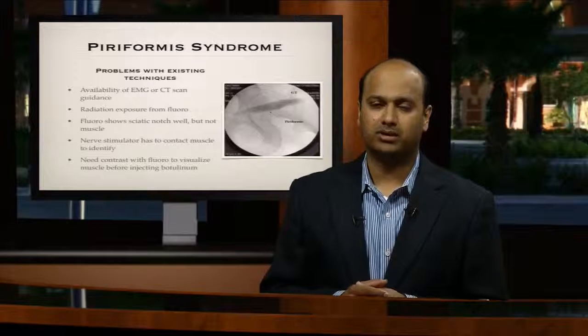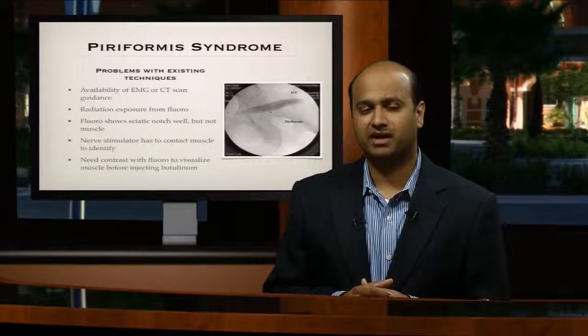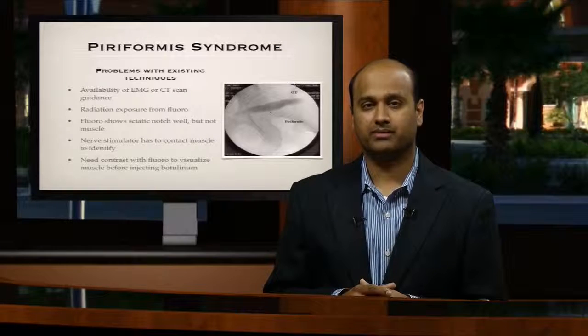Nerve stimulator creates a new challenge. It can be used, but often these patients have very tender muscle tissue, and stimulating the muscle tissue throughout the process can cause undue discomfort to the patient.